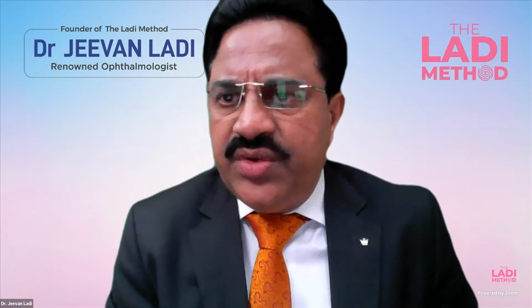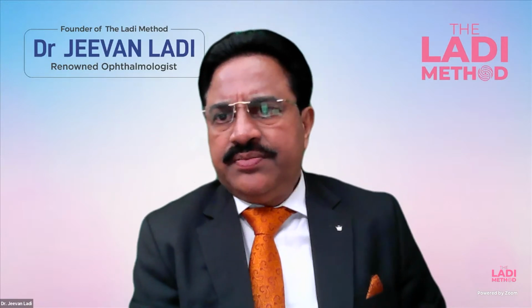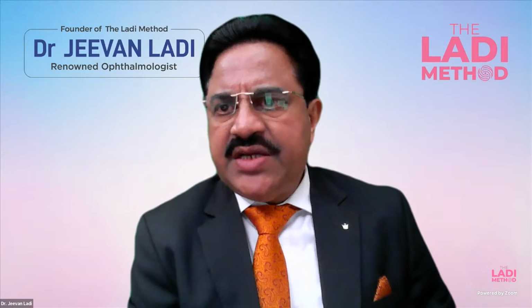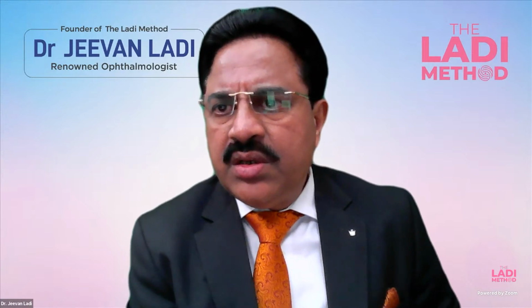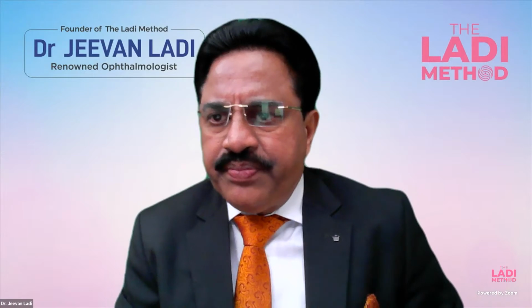You can do the study on your own. In fact, in the Barrett Universal formula, there are two more parameters given which are not mandatory. One is white to white, and second is lens thickness. Now, lens thickness you can get with immersion scan, that also you can include, and you can do the study and find out how it is going to be.